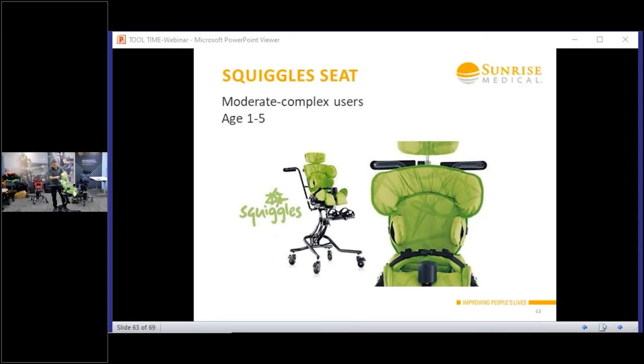So the main difference on all the Leckey chairs, you've got a safety device. I don't know if you'll be able to see it on this one, but you've got a pin. When we get to this pin, stop moving. So if that pin is locked, you see that pin there, when it's actually locked in place, that will stop the actual mechanism from moving. So it won't actually move at all. So that's stopping the high-low, okay? And Rob's unlocked that pin, and now it can go all the way down to the ground.